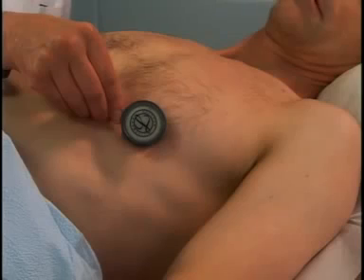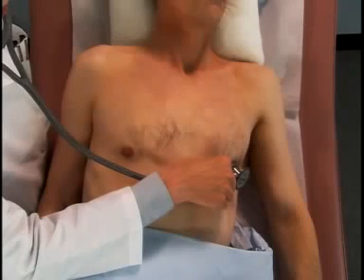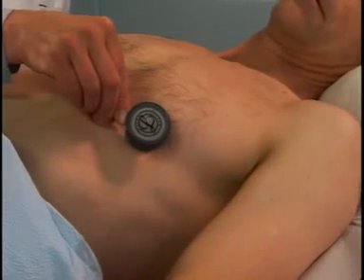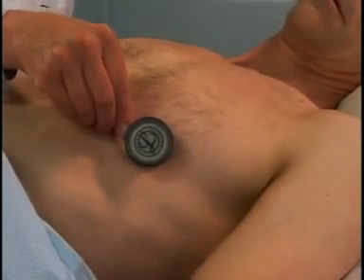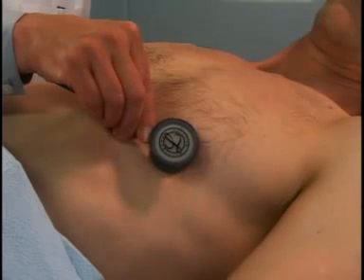If the patient had an audible S3, it would sound like this. Now, notice how the third heart sound disappears when the bell is placed more firmly on the chest wall. Listen again with light pressure, with firm pressure, and once again with light pressure.